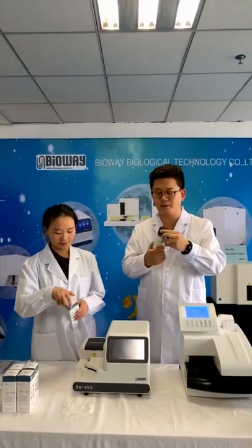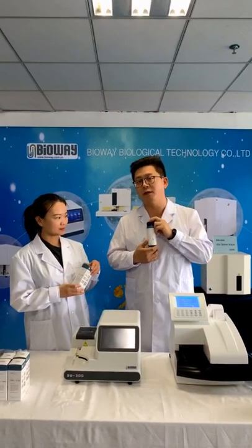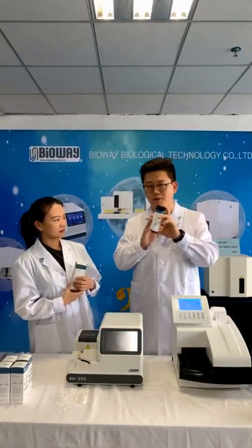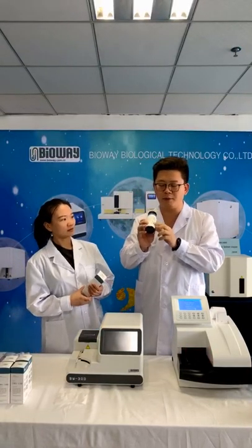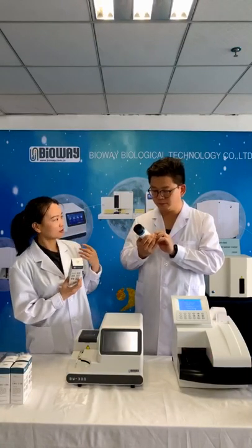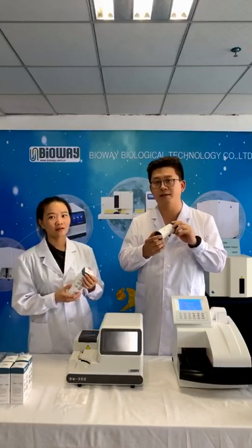The bottle of the urine strip is just like this one. This is the box and this is the bottle. There is a label on it. What is the material of this bottle? It's plastic and it's totally black.